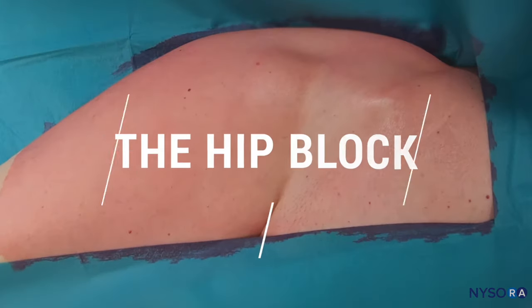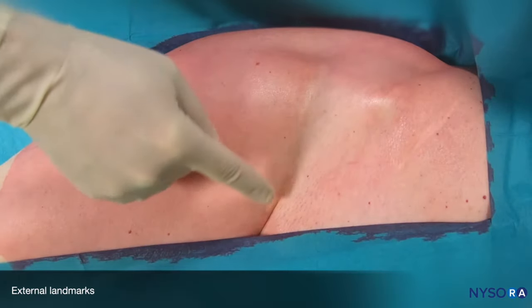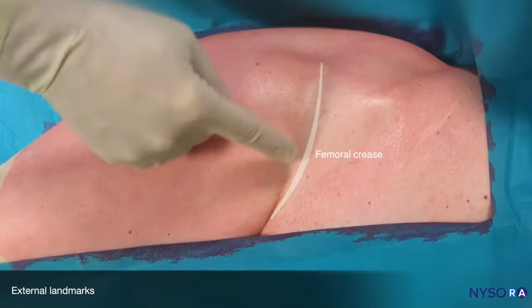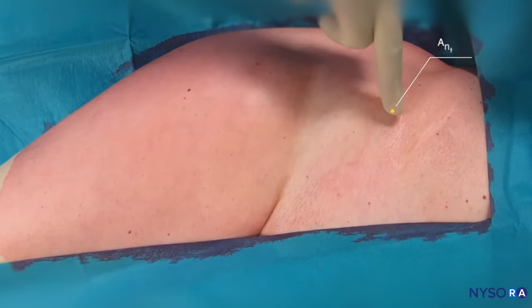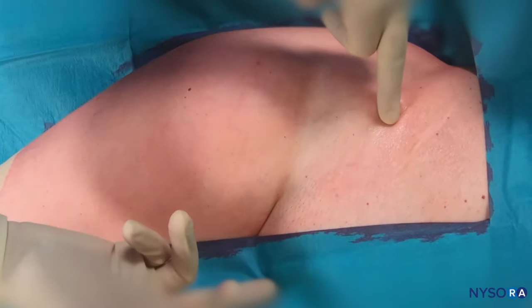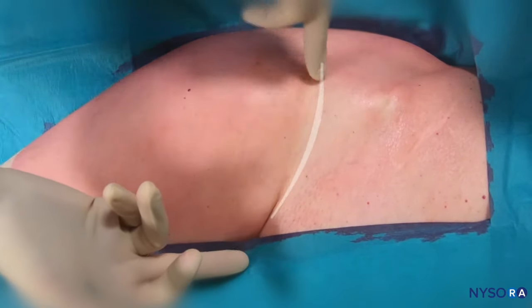We start with the external anatomy. This is the femoral crease, and that is the anterior superior iliac spine. From the anterior superior iliac spine to the pubic tubercle, that's the inguinal ligament. And just for orientation, this is the femoral crease.